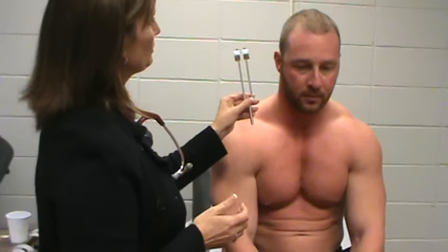Now, this one is checking your bone conduction versus air conduction. In individuals that have normal hearing, you should be able to hear sound twice as long from your ears for air conduction as you do on the bone. So I'm going to strike the tuning fork again. I'm going to put it on the mastoid process behind your ear. And when you stop feeling it, I want you to tell me that you can't feel it anymore. Then I'm going to move it to the front of your ear, and I want you to tell me when you stop hearing it. Okay.